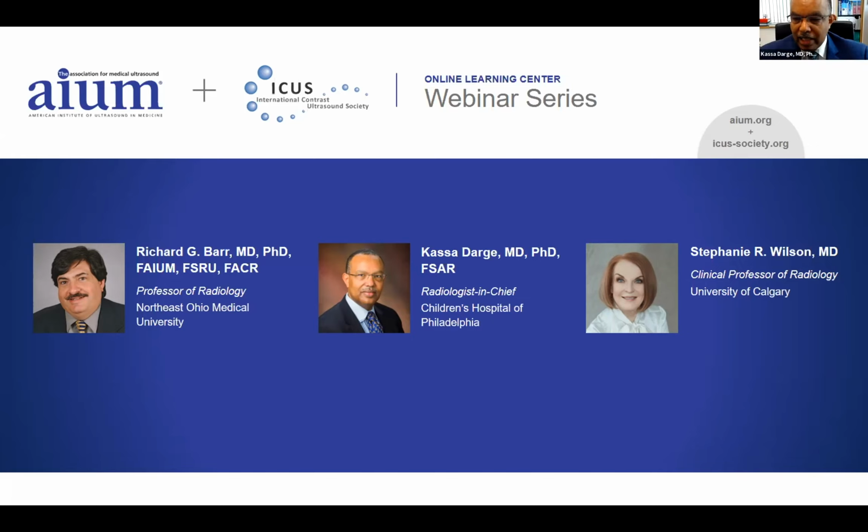Stephanie, if I may add to that, I think what you say now is absolutely important. And this is something I really pushed from the beginning so that the contrast examination would not only stick on me, but be spread out to everyone. So the way we trained our pediatric radiologists is to create what we call a buddy system. When one does an exam, they call another one to teach.